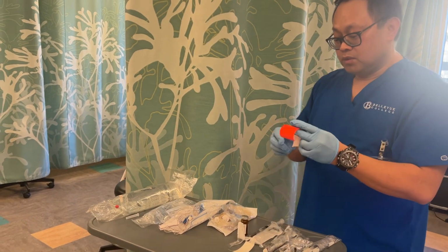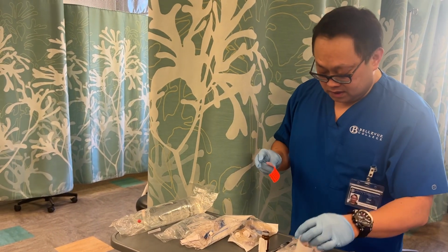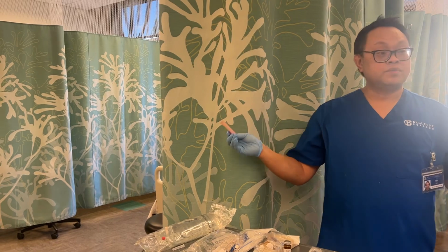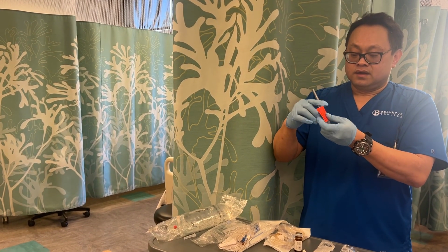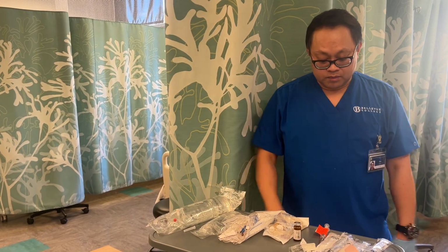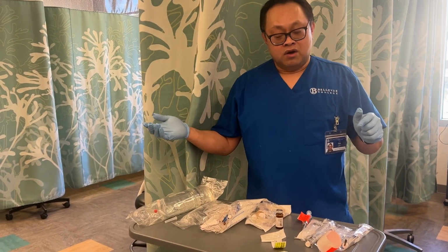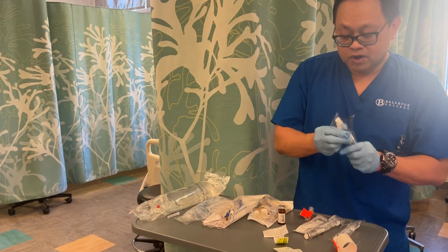Okay, I'm going to label each of the medications, right? So the drug, the additive, the amount, who added it, which is me, the date, expiration date, and time. Okay, I'm going to label that. I'll label these bags when I hang them up. Okay, and there are some tubing labels that I'm going to want to go over. We're going to want to change the tubing every 72 hours. Okay, and then I'm going to prepare my flush.